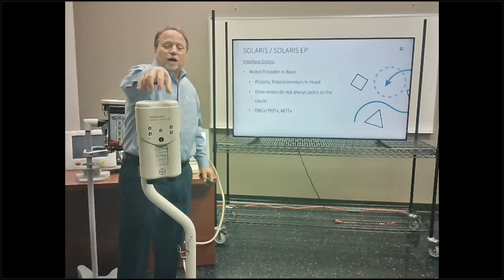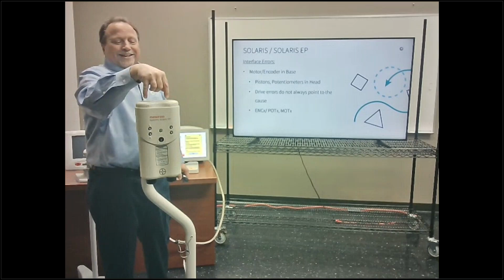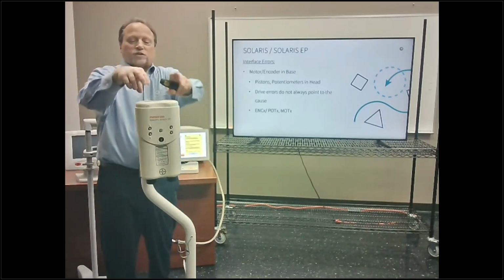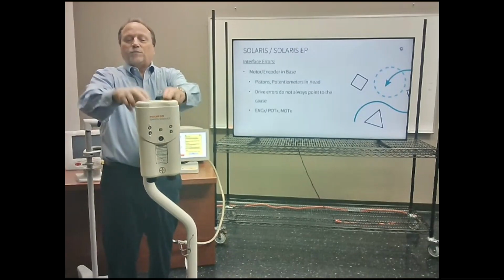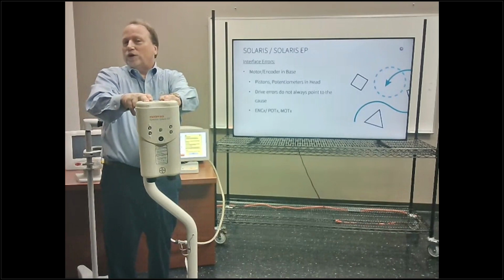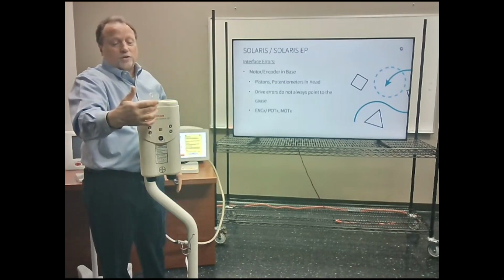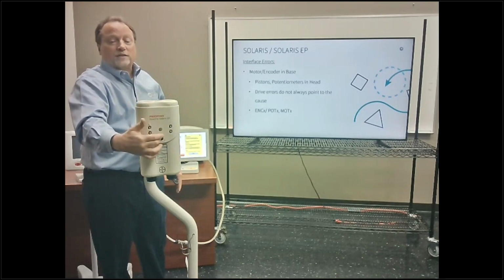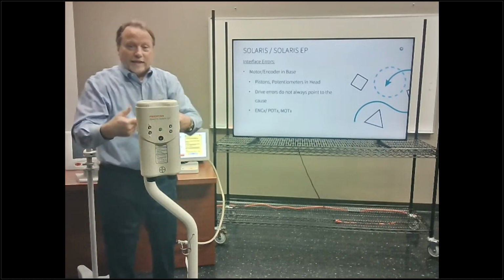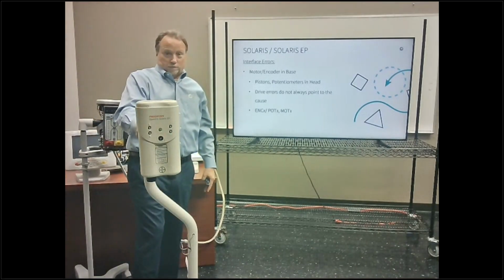Interface errors. That's the top up here where you put the syringe in. What usually happens is we get syringe interface errors. Everyone goes right to the top here to look. Very seldom do they get damaged unless you damage them yourself by not paying attention to what's going on or put it in incorrectly. There is an interface board right in the center. Everything is fed to that interface board, to the head cable, down to the pedestal, to the base interface board.